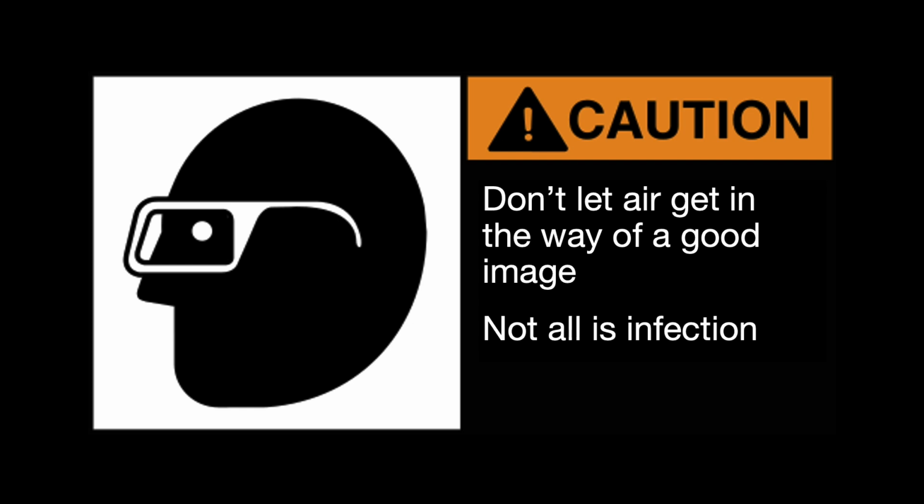Make sure that you don't let air get in the way of a good image. If you're not maintaining good contact, make sure that you do use a water bath or a standoff pad and do not cheat yourself from a good image. And also just always remember that not all that is anechoic or a fluid pocket is infection.